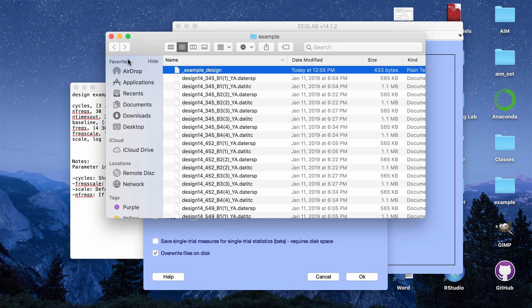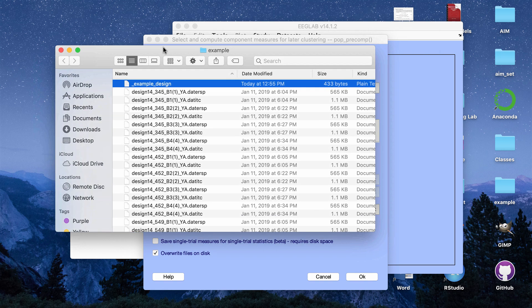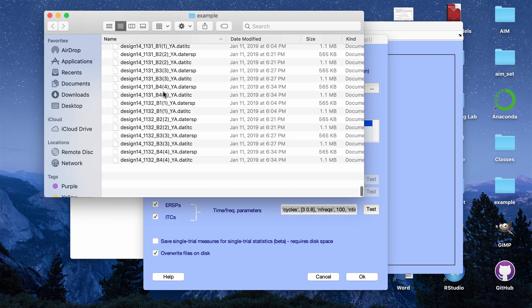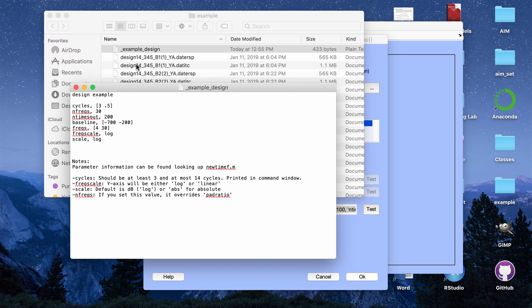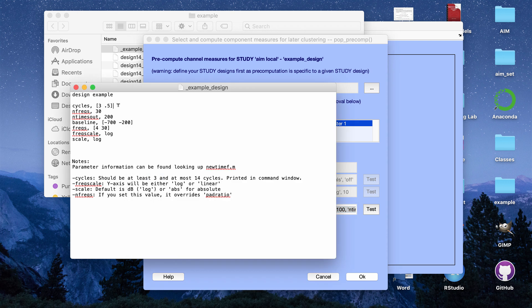When I create time frequency plots, I typically create one folder per design. I usually include a text file at the top noting the specific parameters I input into newtimef. I'm going to set: cycles 3 to 0.5, number of frequencies 30, number of times out 200, baseline of negative 700 to negative 200 milliseconds, frequencies from 4 Hz to 30 Hz, frequency scale log, and scale log for decibel power.